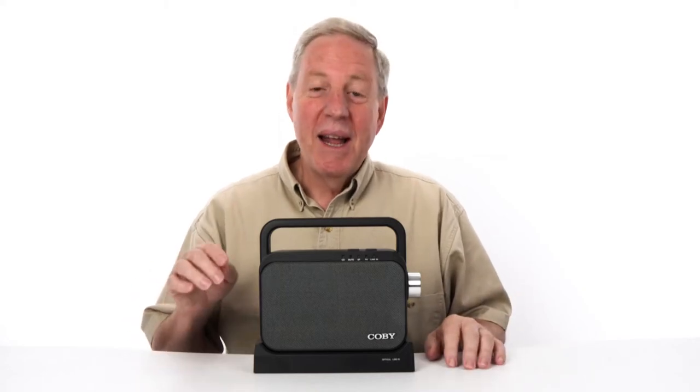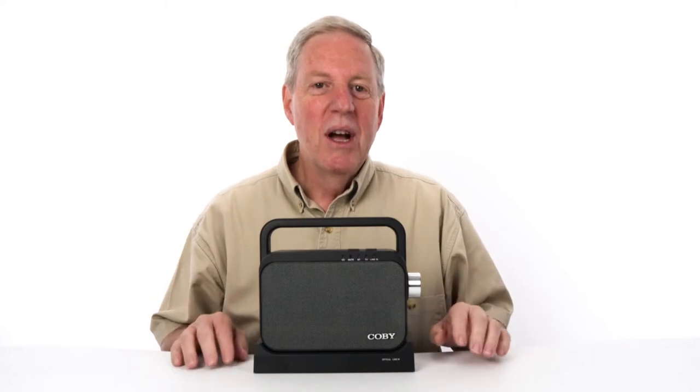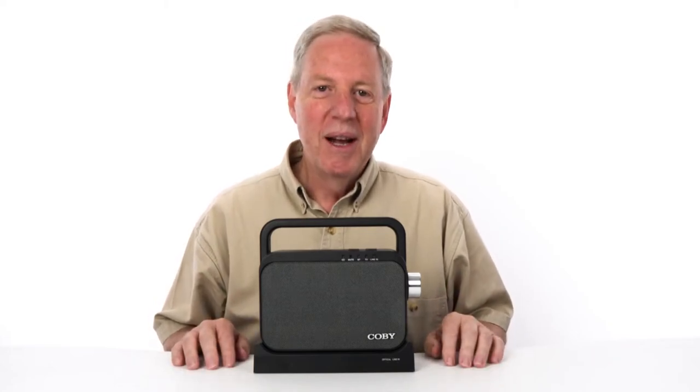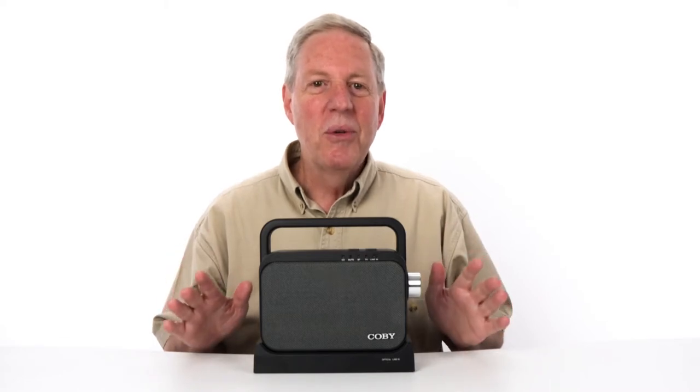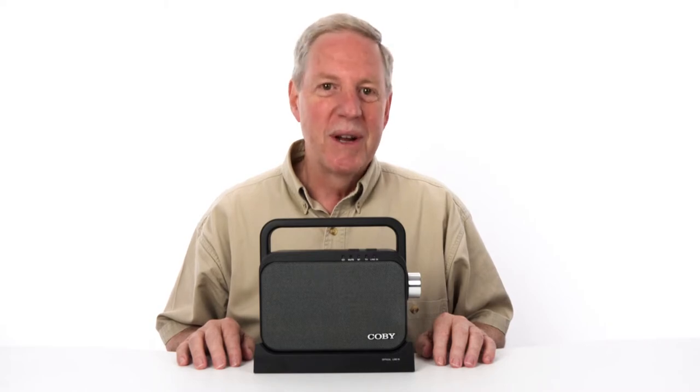Hello, I'm Bob, and today I want to introduce you to the Coby Wireless TV Speaker, a portable TV listening assistance device for the hard of hearing. This amazing device uses voice highlighting, which allows dialogue and sound effects to come through crystal clear.